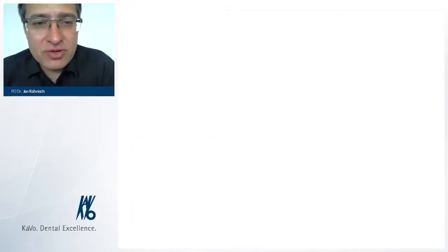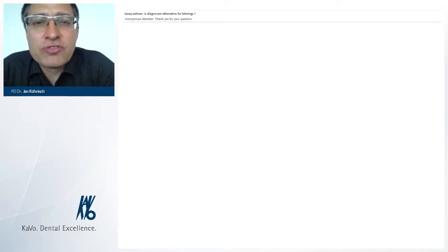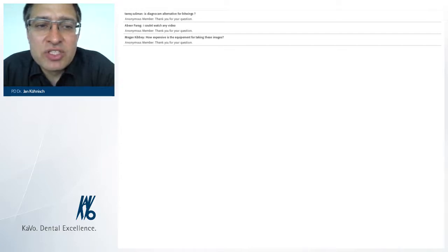Yes, of course, here we've got some questions, and maybe some of you or maybe all of you can see it. The question is: is Diagnocam an alternative for bite wings? There's yes and no. We can detect these lesions at the enamel caries level very early and very sensitively with the Diagnocam. Again, what is the missing piece with the Diagnocam is to see the dental pulp and to have a good staging. For that reason, we will need bite-wing radiographs to diagnose the caries process.